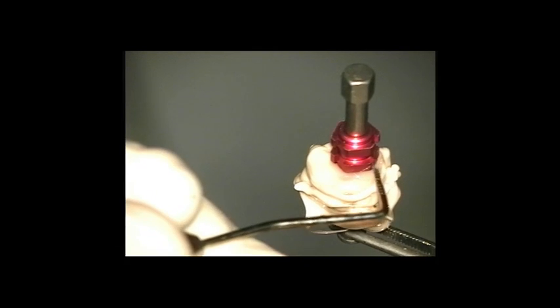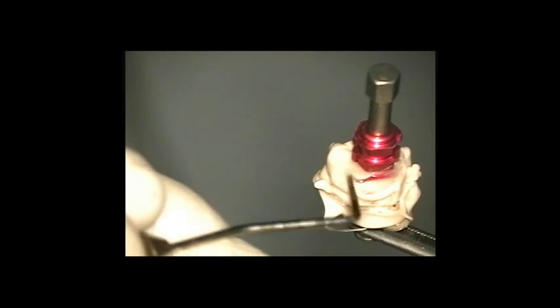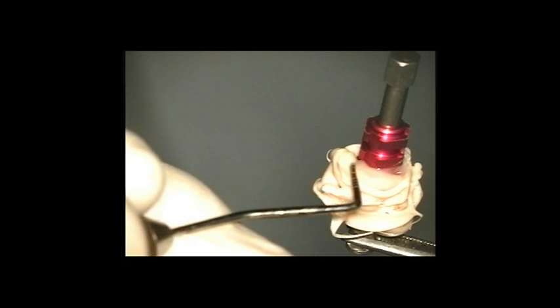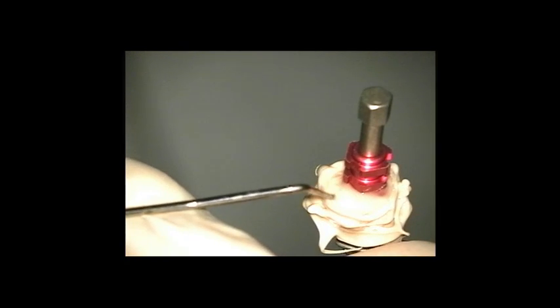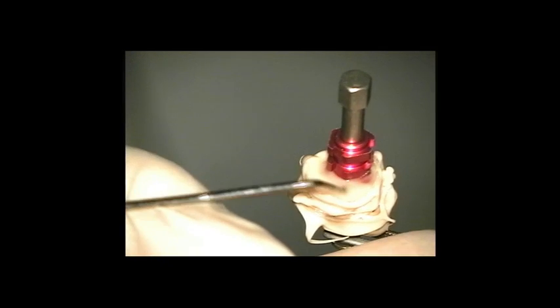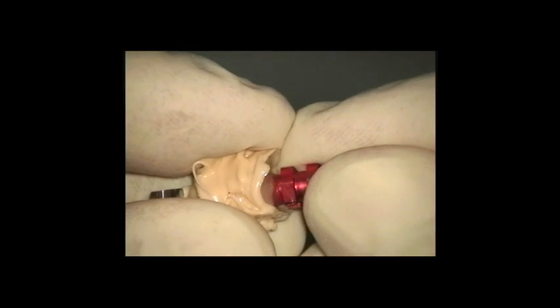So when we place this in the mouth, it supports the tissue the same as the provisional crown. So our impression will have the same tissue represented in it that we have in the mouth. And that's basically the whole point of this. In the posterior part of the mouth, you don't need this as critically, but in the anterior portion of the mouth, in the aesthetic zone, this is an important step to creating a good aesthetic result with implants.